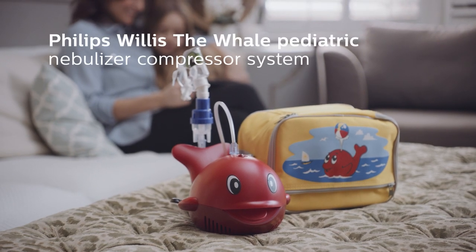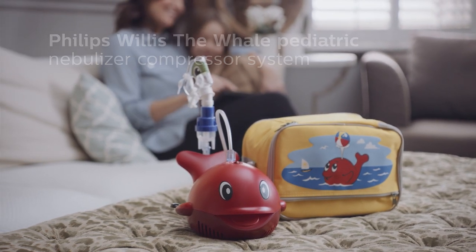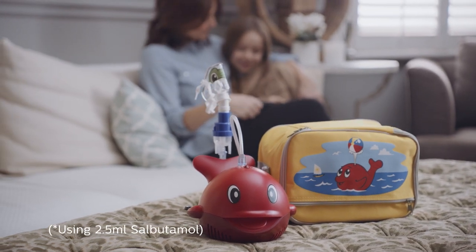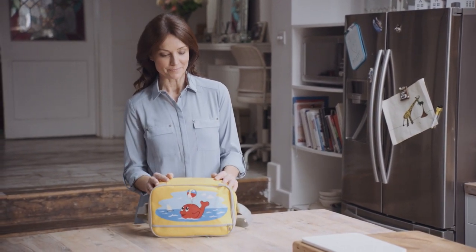Philips Willis the Whale is a child-friendly nebuliser compressor designed to make therapy fun and stress-free. With Philips' highly efficient Sidestream nebuliser to provide fast treatment for children, treatment times can be as short as 6 minutes. This video shows the different steps to using the Philips Willis the Whale paediatric nebuliser compressor.